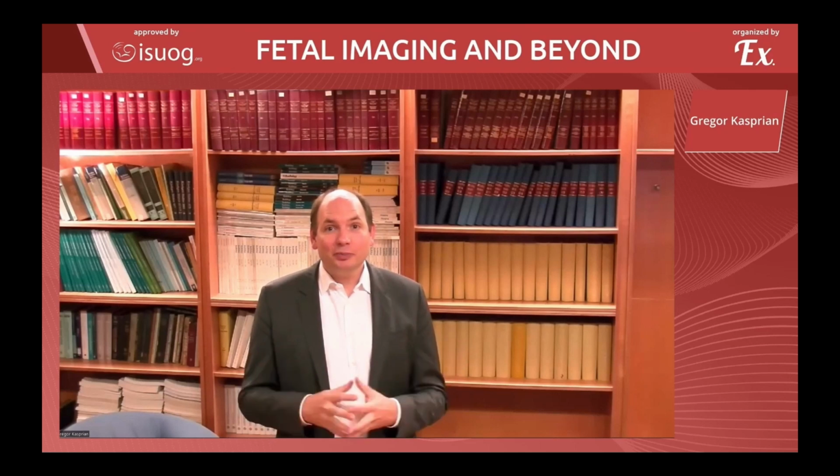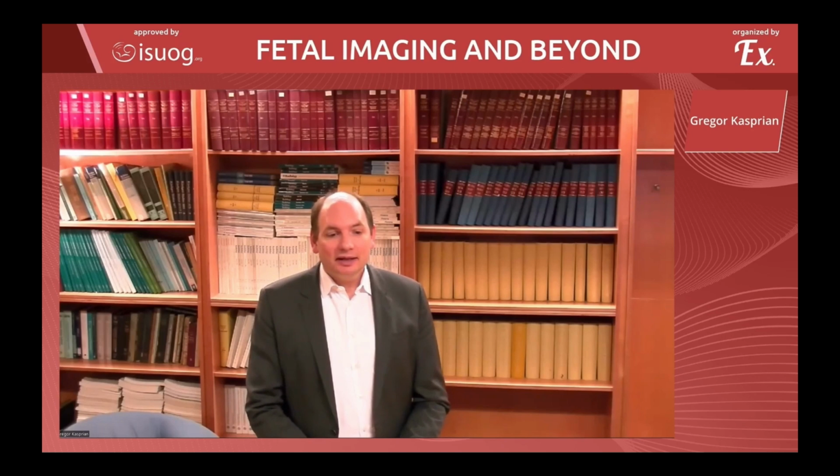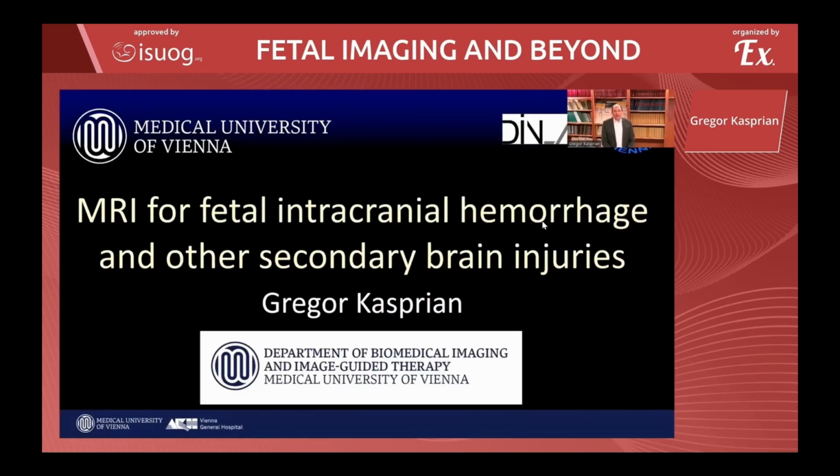A great pleasure to be part of this online meeting again. The topic I'm going to present on is intracranial hemorrhage. I'm very pleased to do so, and I will do it from the perspective of a radiologist using fetal MR.